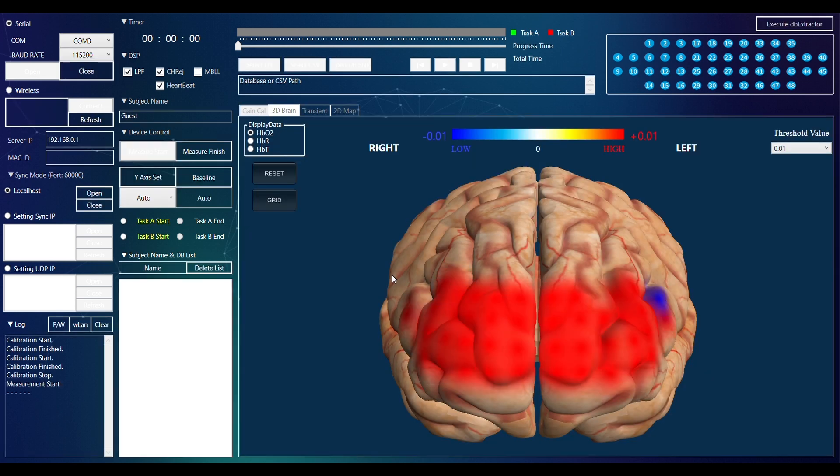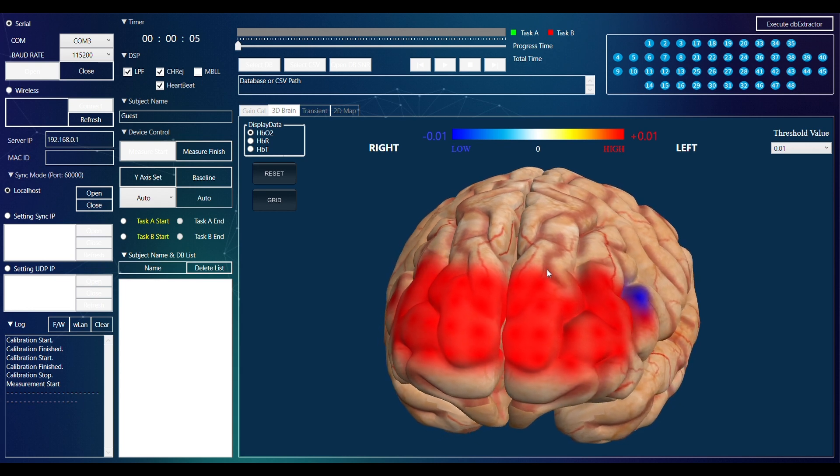You can visualize the brain in 3D space and drag onto the image to rotate the brain.